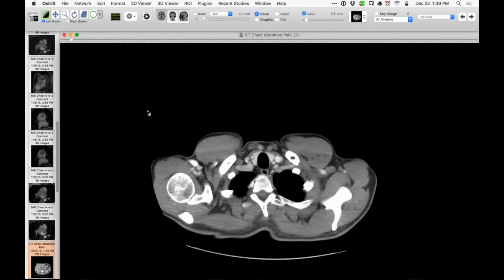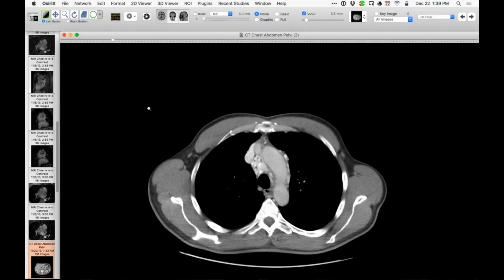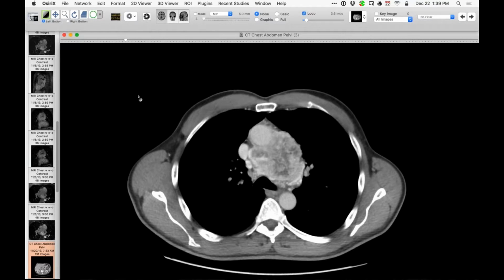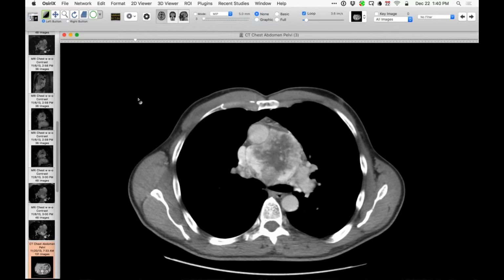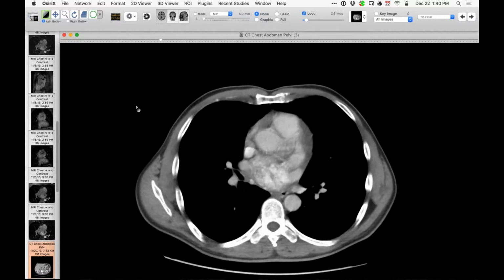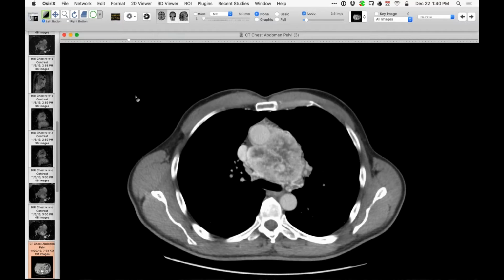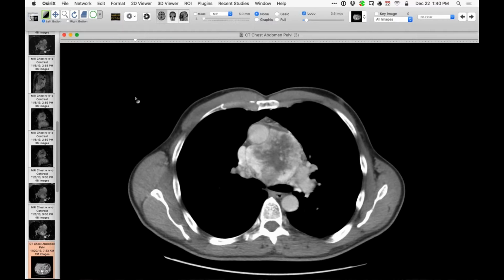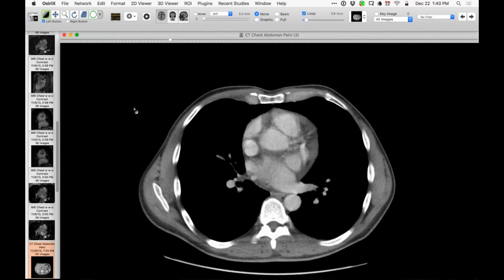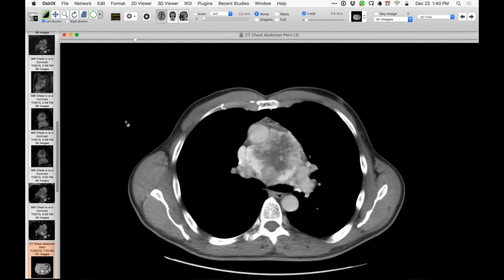This was a person that was imaged in the context of a diagnosis of CLL. So everything you're going to see here was a big surprise. A huge mass. You can see its location, its size, how it enhances with contrast medium, lots of areas of necrosis within, how it's growing between structures and pushing structures away. And ostensibly, he wasn't even symptomatic from this. This was a big surprise.